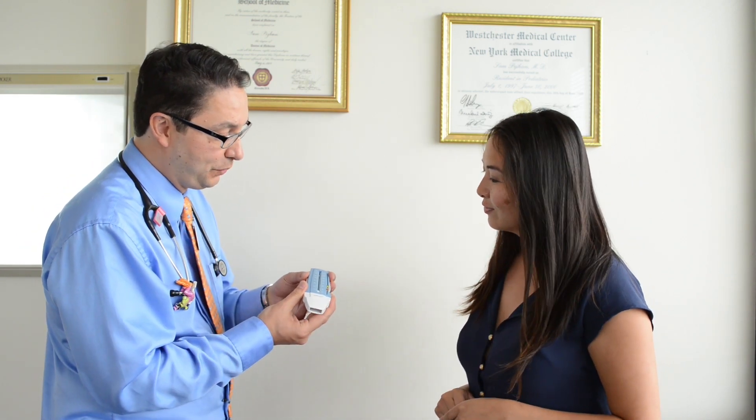I have the AsthmaMD peak flow meter here with me today. The reason we recommend using a peak flow meter is because 50% of asthma patients don't realize how bad their asthma is, and so it is recommended to use a peak flow meter to accurately track your asthma symptoms.